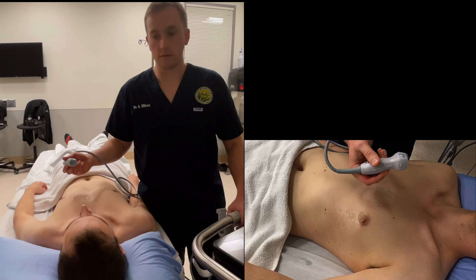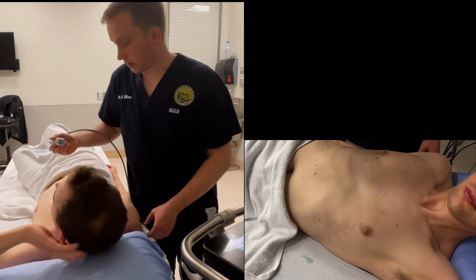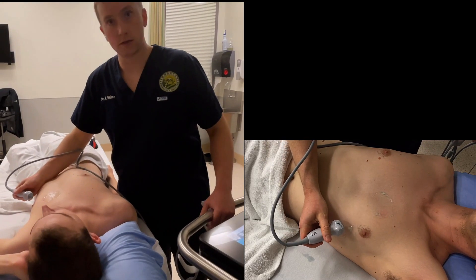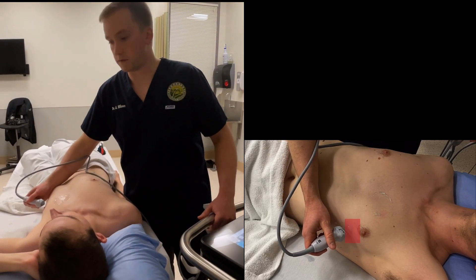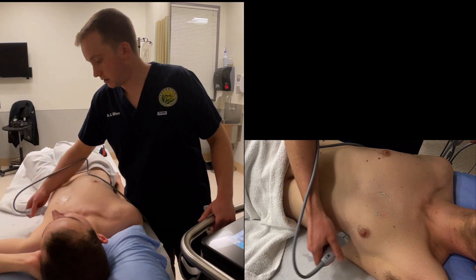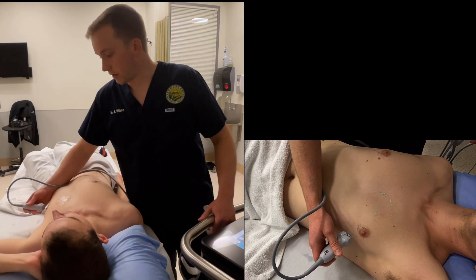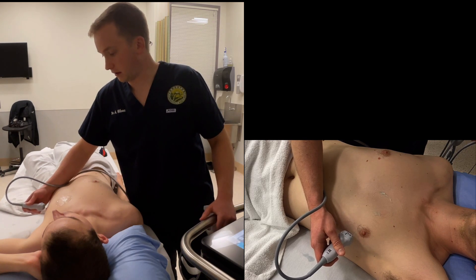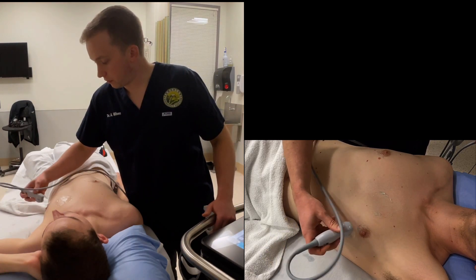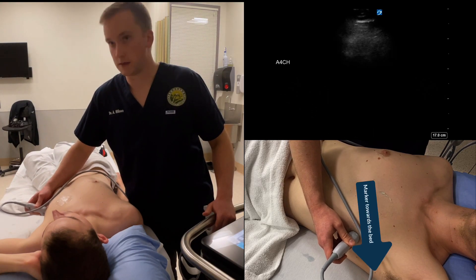Next, we'll talk about the apical four-chamber view. This is arguably one of the more challenging views to obtain. It can help to have the patient turn to the left lateral decubitus. Generally, the apex — the area you want to start imaging — is located in the midclavicular line in the fourth or fifth interspace. In males, this can be approximated by going left and inferior to the nipple. In females, this can be approximated by going underneath the inferolateral portion of the left breast. To obtain this view, find your apex and orient the probe so the marker is facing down towards the stretcher.